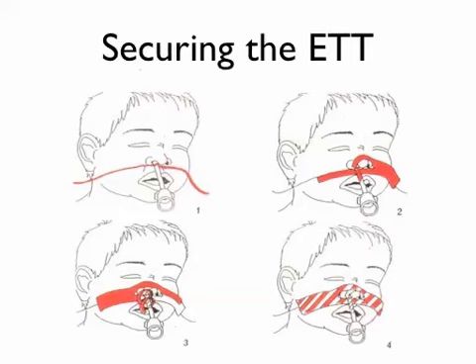You're going to do what we call the moustache, so put one leg of the tape across between the upper lip and the nose. Try not to get it stuck on the lip itself, so just between the lip and the nose, and that piece goes across, making a moustache. Then the top trouser leg from that piece goes over the top of the nose and then comes around and spirals around the nasal tube where it comes out.